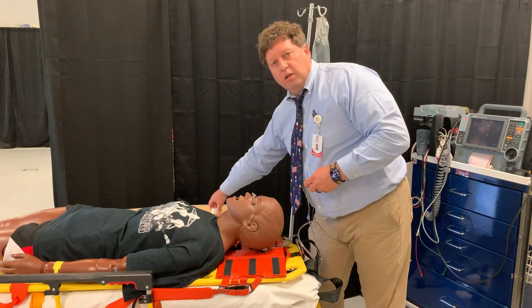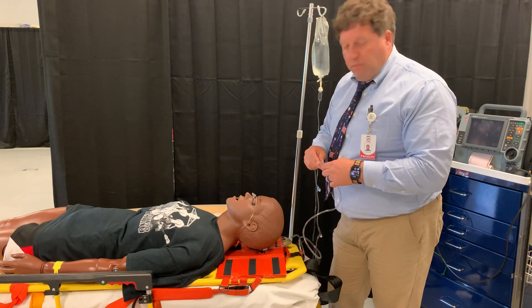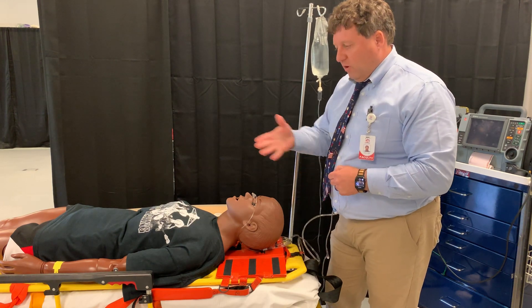Just a little trick to help flush somebody's eyes out while we're transporting, or even while we're not, if you just want to keep your hands free to go do something else.